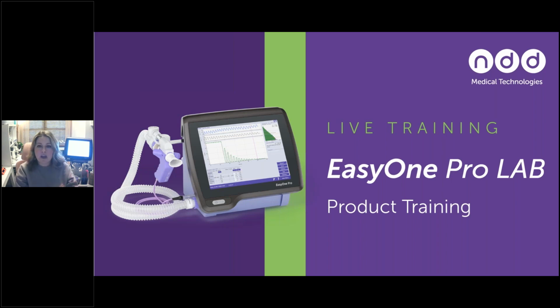So experiment with your SVC methods to confirm that you have both an IRV and an ERV in the SVC, a reserve volume and an inspiratory reserve, to carry over. Make sure that you can see those parameters, because you're right, sometimes those get missed in SVC, even though you did an SVC and it looks really good. Like I said, I see this the most in obstructive patients who are trying to do the inhale first method. Swap them to exhale first, confirm that you are getting all of your different volumes in SVC, and then they should populate over to TLC.